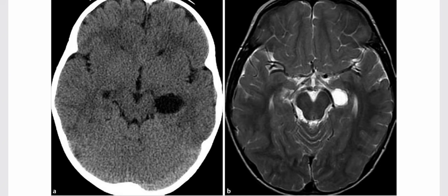So considering the key imaging finding here of a CSF cyst within the choroidal fissure, obviously the diagnosis will be choroidal fissure cyst. So this is a case of choroidal fissure cyst, which is a type of neuroepithelial or neuroglial or arachnoid cyst, which basically occurs within the choroidal fissure.